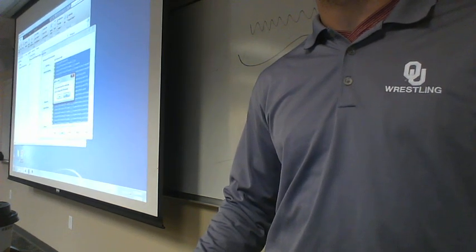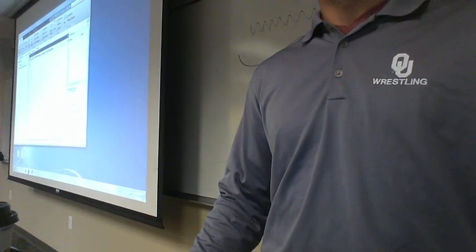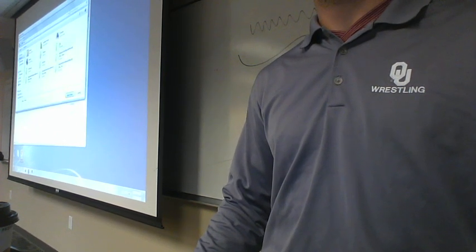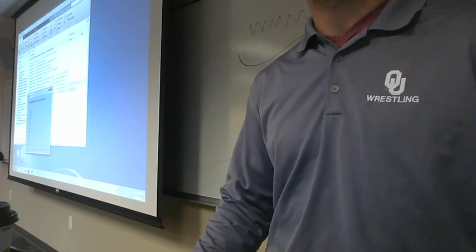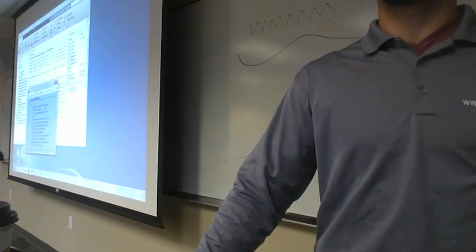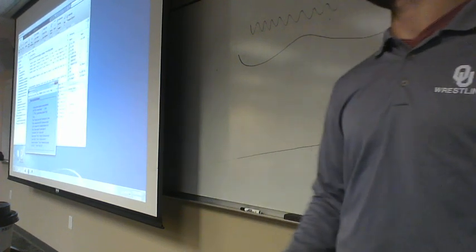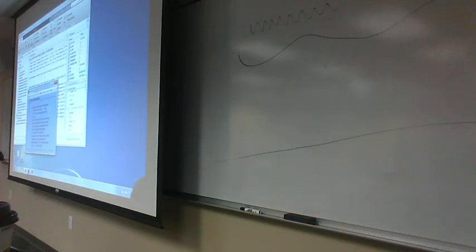Because there's like a student version, there's a lab version. I don't know if this is student version. Does it work with all of the plugins then? Well, I shut it. I went to the task manager and shut it down and just reopened it. Like you might need to just restart or log out or log back in or do something.